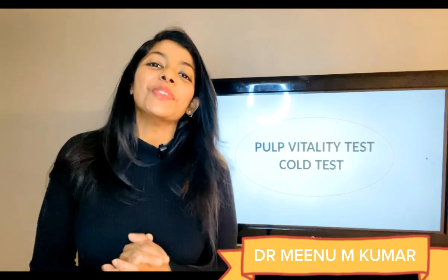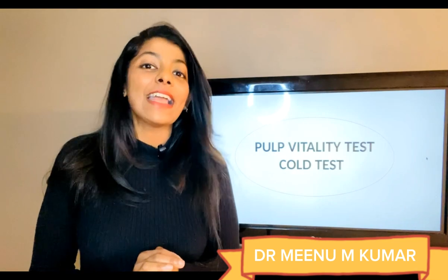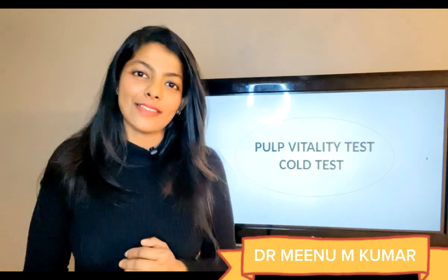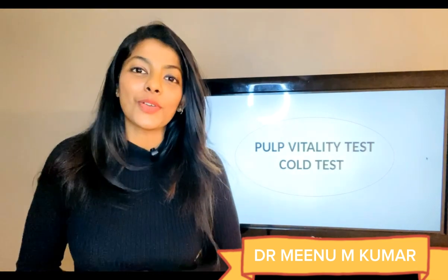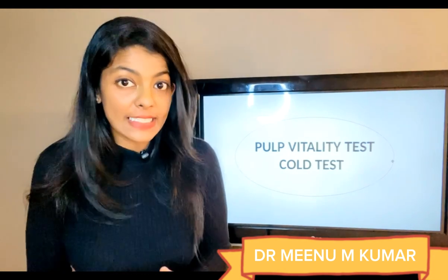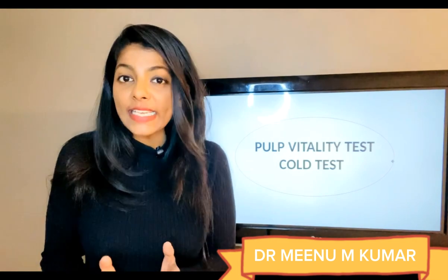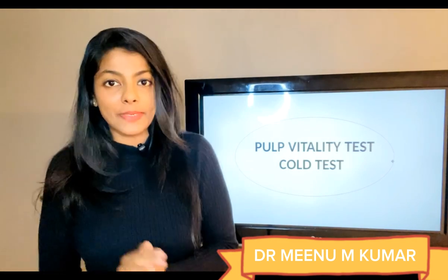Okay. So last section we were discussing the pulp vitality test, and in that we were focusing on the heat test. So today we are going to discuss the cold test. The cold test is a neural sensibility test in which the status of the pulp is evaluated by stimulating the nerve fibers within the pulp.